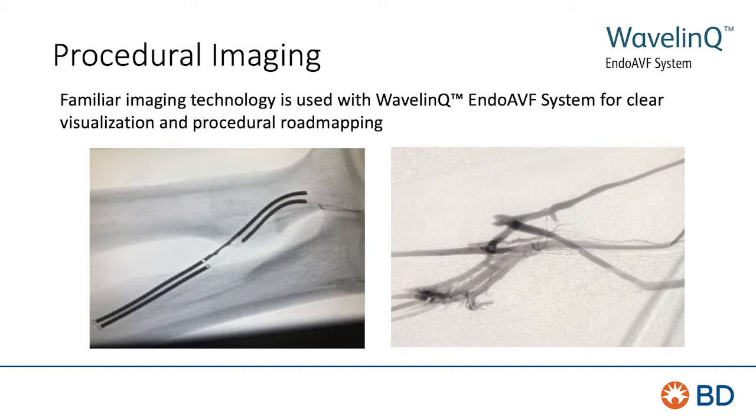So what you're seeing on that screen right is the arteries, the veins, the fistula in the center of the screen, a nice big perforator carrying that flow superficially into a cephalic and basilic vein on the top and bottom of the screen, exiting screen right. You can also subtly see that little coil in the brachial vein just central to the fistula itself.